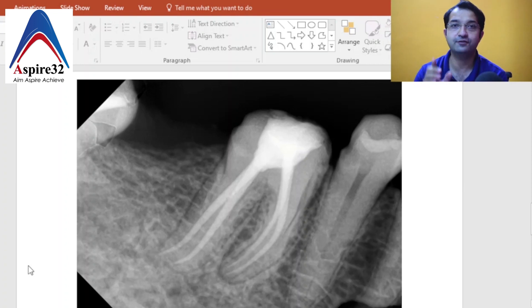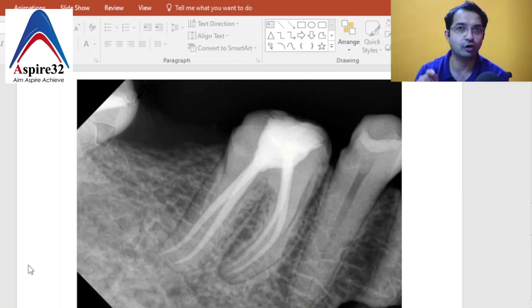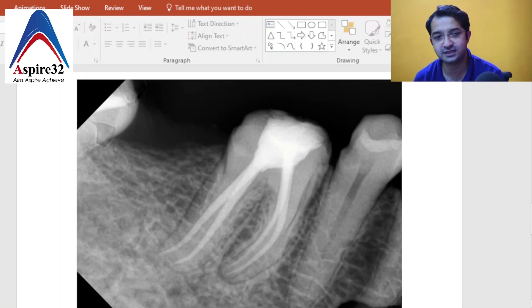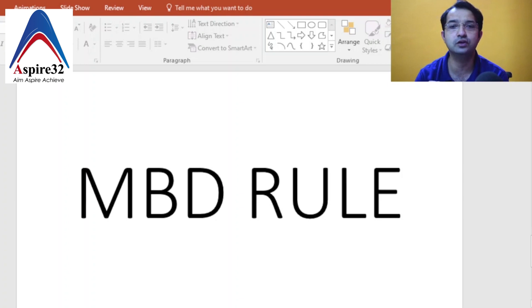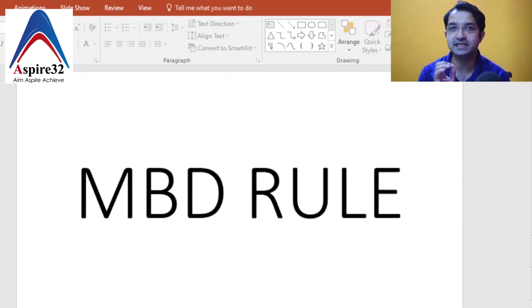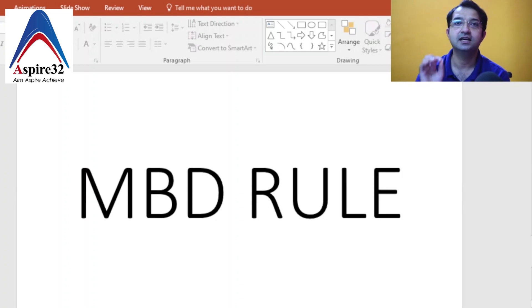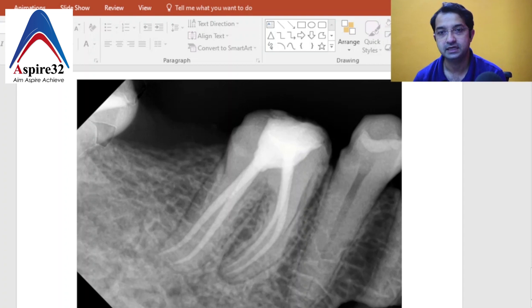Now if I ask you which separated canal is buccal and which is lingual, you would think of the SLOB rule — 'same lingual opposite buccal' — which becomes really confusing. So there is a very simple rule to identify this, called the MBD rule. MBD means: the mesial buccal canal is always distal to the mesio-lingual canal when you give mesial angulation.